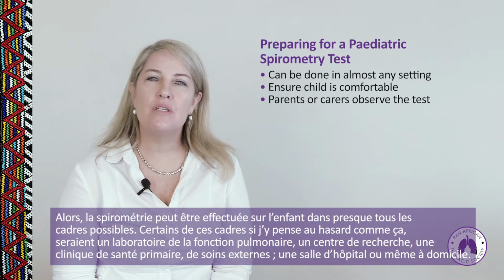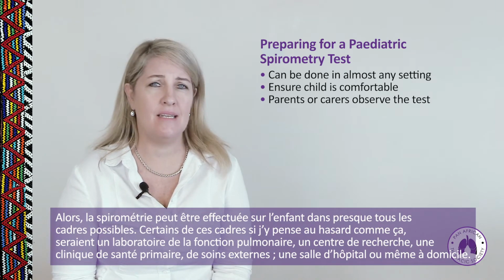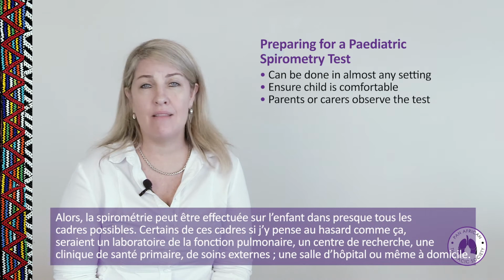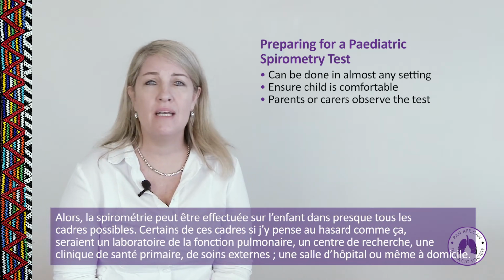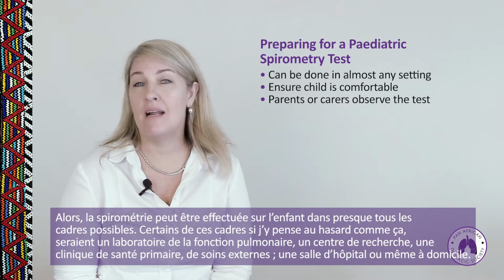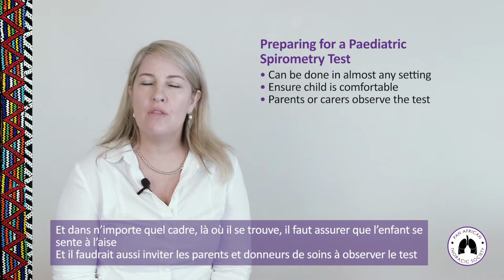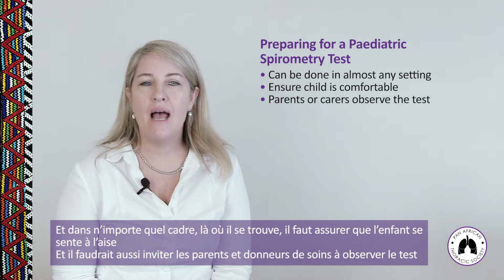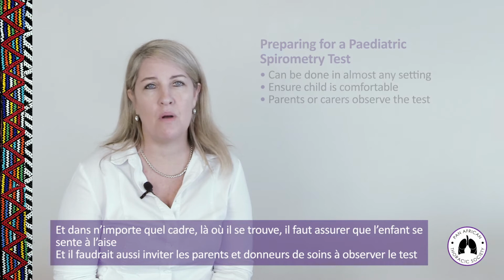All right, so spirometry can be carried out on children in almost any setting. Some of the settings that I can think of off the top of my head would be in a lung function laboratory, in a research facility, in a primary healthcare clinic, in an outpatient clinic, in a ward, and even at home. So the child in any scenario, wherever they are, should be made comfortable, and parents and caregivers should be invited to observe the spirometry test as well.